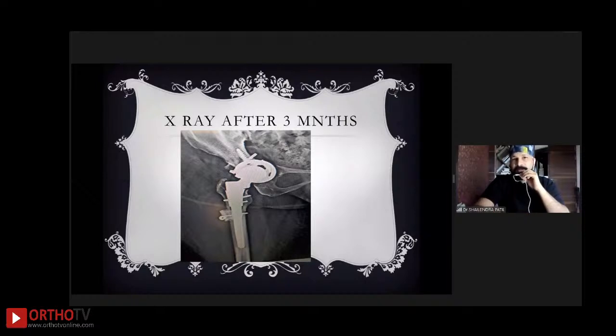Cemented cup was not possible in this case. Taking out this cup and putting it back again, as I was the one who had the first hand feel of the bones and quality from the primary, was not the option. So I changed the poly and reversed the direction of the lip.